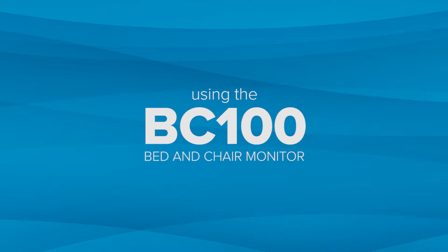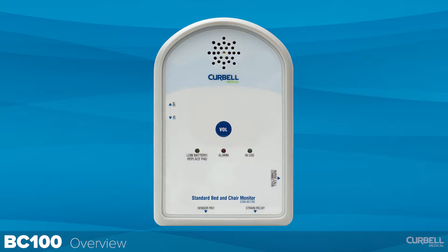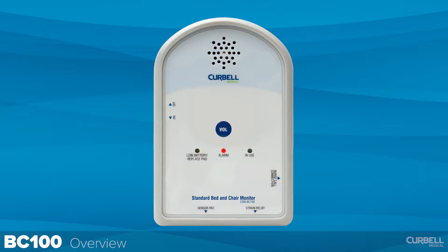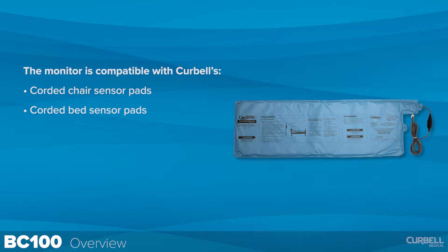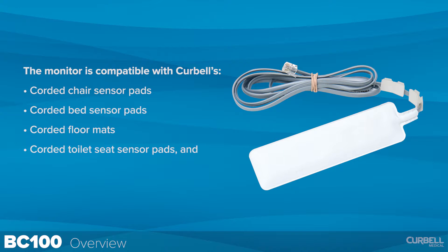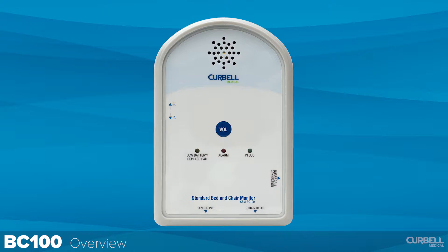The BC 100 bed and chair monitor overview. The BC 100 bed and chair monitor monitors a bed or chair for occupancy. If a patient tries to leave the bed or chair, the monitor will signal an alarm notifying you to check the patient immediately. The monitor is compatible with Kerbel's corded chair sensor pads, corded bed sensor pads, corded floor mats, corded toilet seat sensor pads, and corded seat belts.